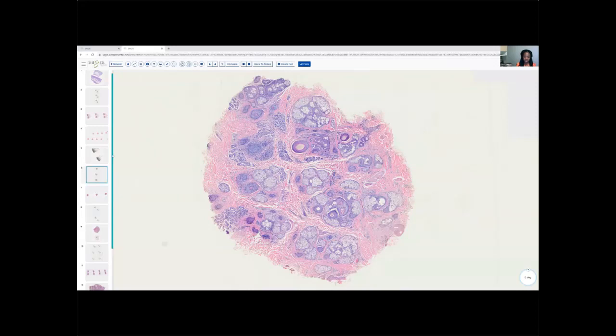And then we started talking about some of the scarring alopecia. So we've looked so far at Lichen planopilaris and its family member, frontal fibrosing alopecia. We've looked at Discoid lupus. So let's keep going with those more scarring alopecias.